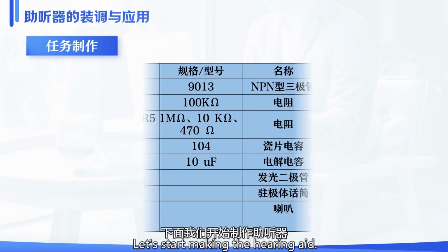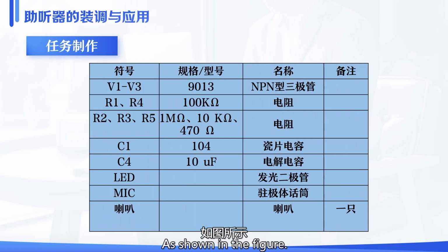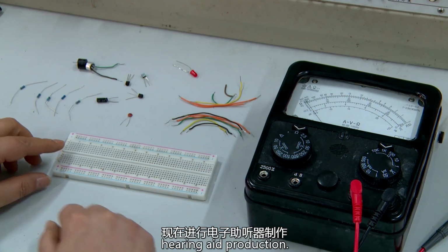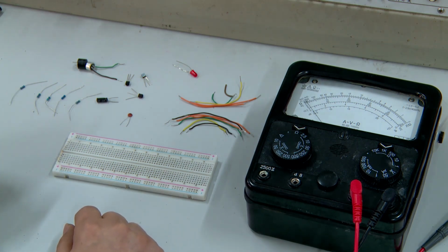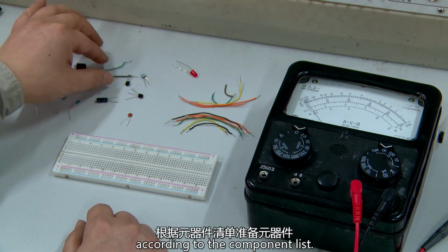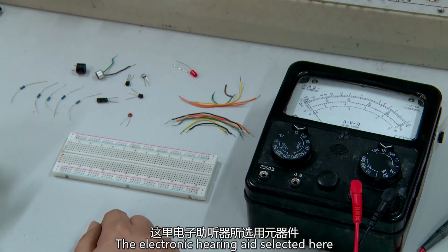Let's start making the hearing aid. List the components and materials according to the circuit, as shown in the figure. Prepare the components. Now proceed with the electronic hearing aid production. Prepare the components according to the component list. An electronic hearing aid is selected here.